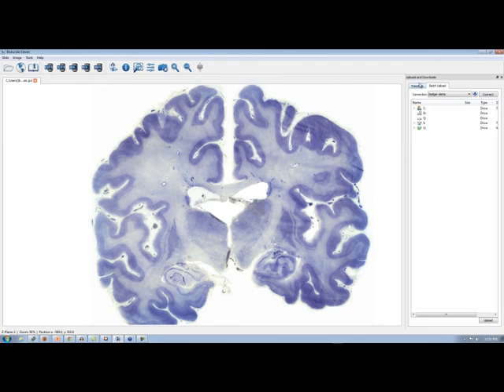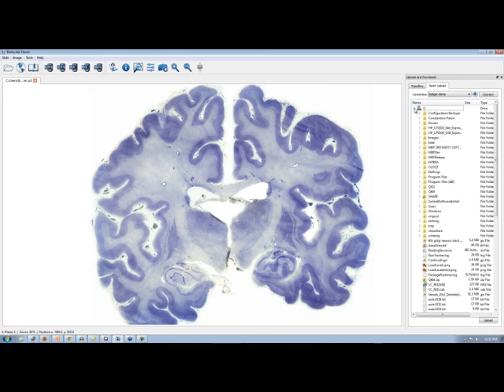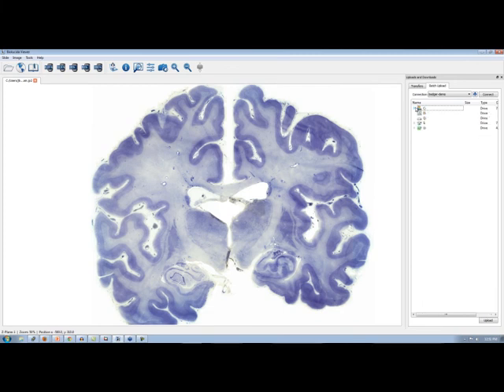This is what we have called a batch upload. So we have two tabs here. One is called Transfers, one is Batch Upload. Batch Upload is simply you select the directory or images that you want, hit upload, they all get uploaded at once to the server. So this is very useful for example, a lab who's just starting to use Biolucida Cloud.